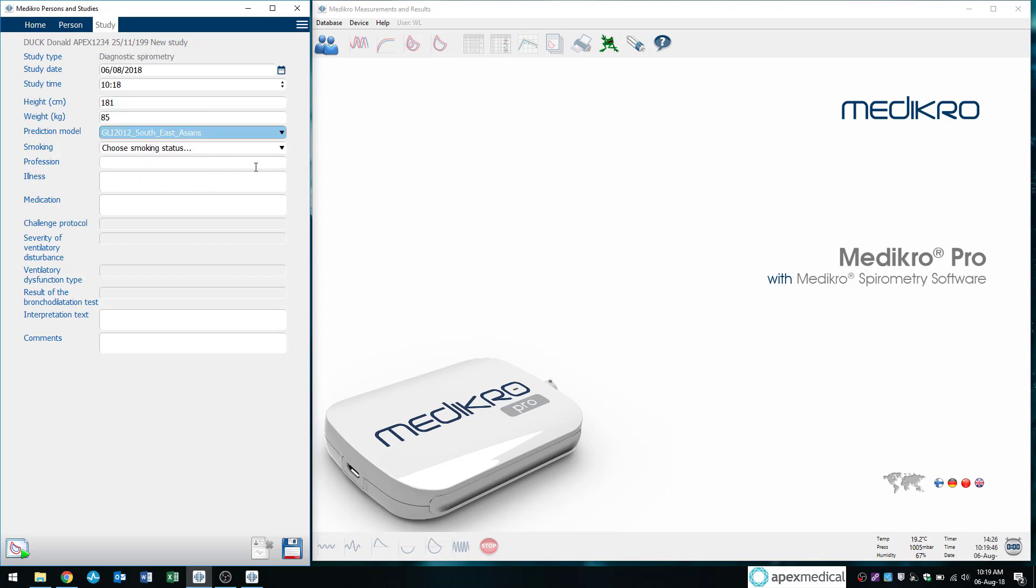And these white fields you can choose to fill out or not. For example, you may want to check if a patient's taking any inhalers within the last 24 hours. So you can make note of that.